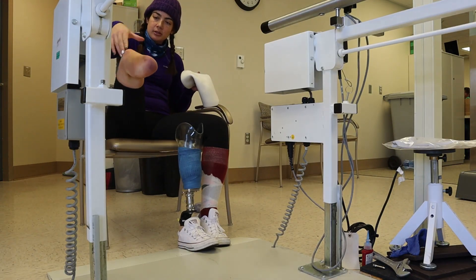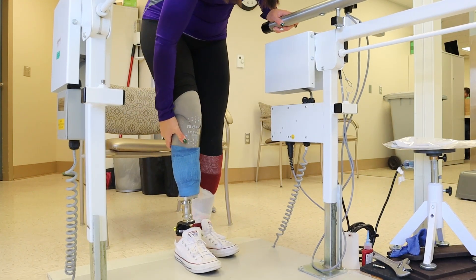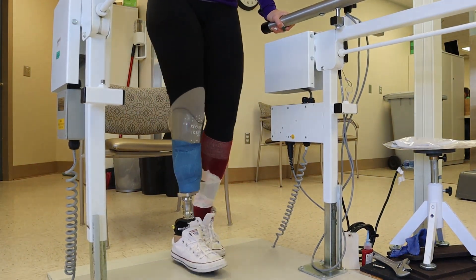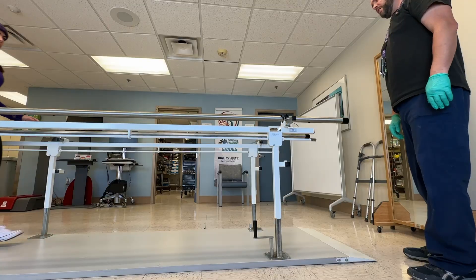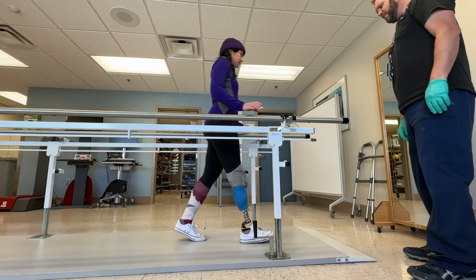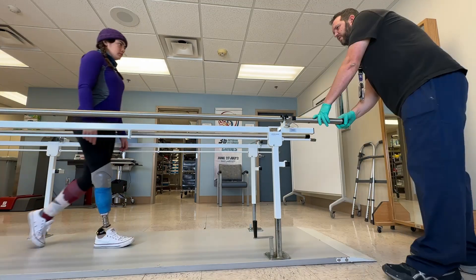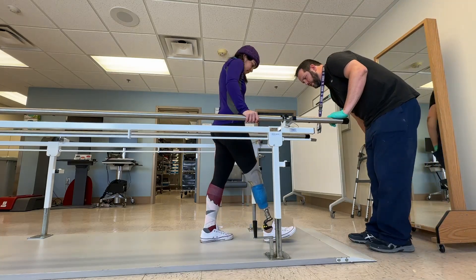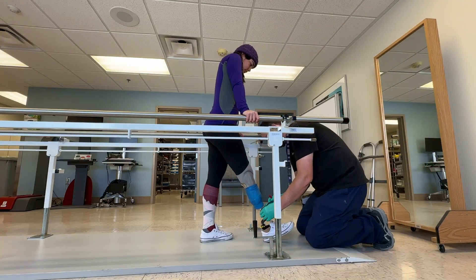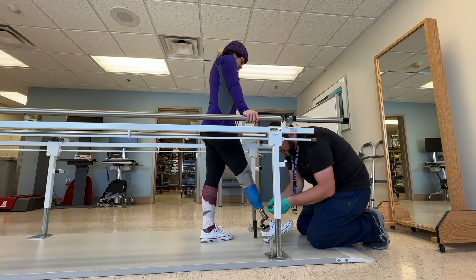Oh, right at the bottom. There you go. I definitely don't like that back. Your alignment's off for sure. The back looks bad, and it almost looks like because of the boot. I feel like I'm walking crooked. Yeah, and you are for sure. I'm going to adjust that right now. Then we'll get that back taken care of. If it's driving you nuts, we can do it at any point — stop right now and I can go address it, or we can keep going with alignment and get it closer.